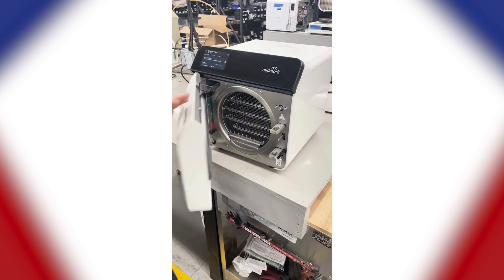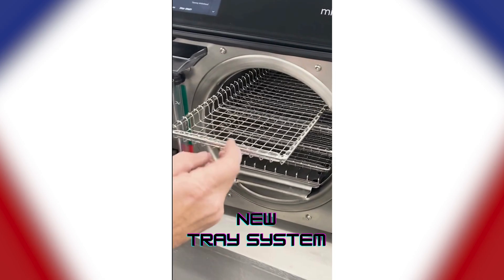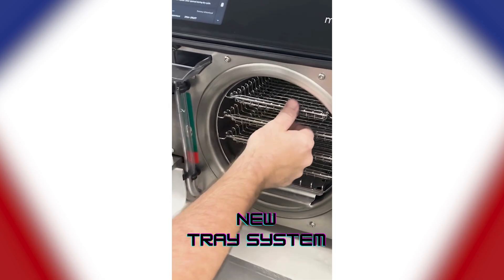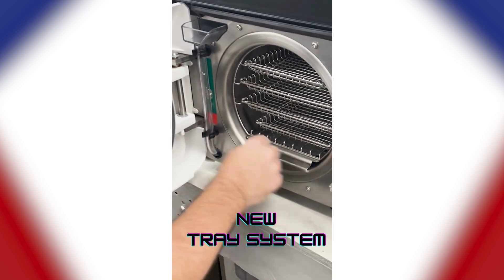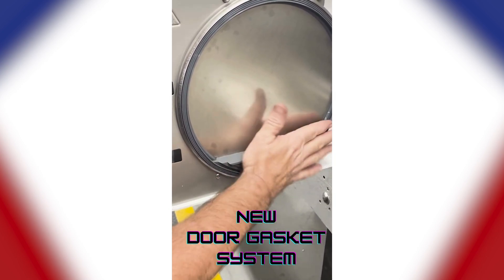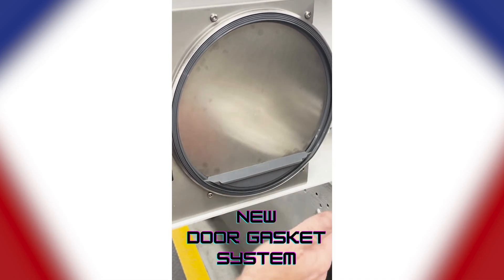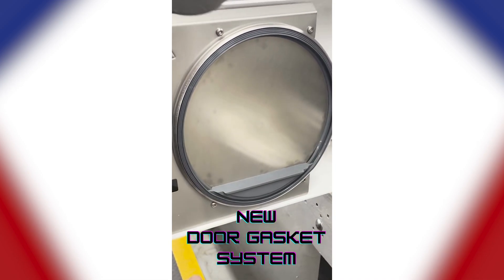If you take a look on the inside, new tray systems, which will allow for a lot more steam penetration in my opinion. They did change the door gasket system. There's a different type of ring, which hopefully is going to hold everything in there a little tighter now, though it will take a little bit more effort putting that gasket in.